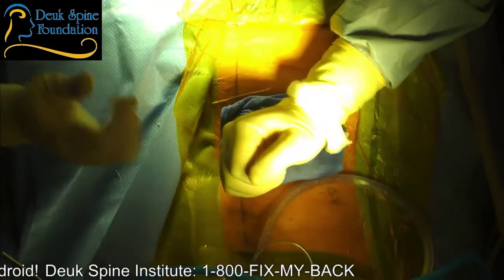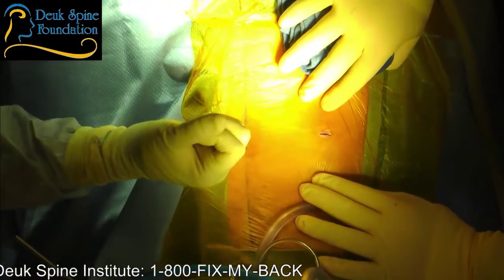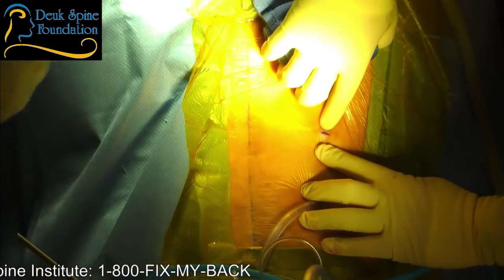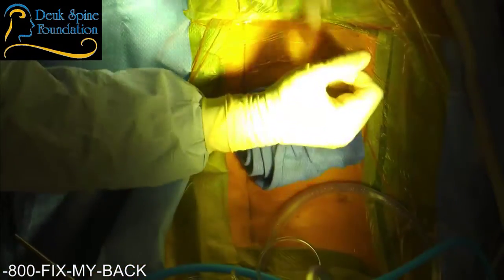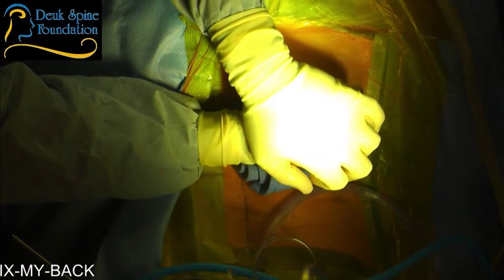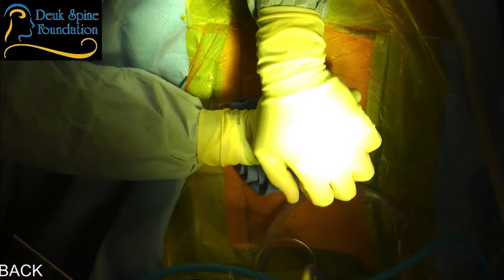All right, you got pressure there? You see the incision, everyone? It's as wide as my fingernail. Tiny, tiny, tiny. So, great job, everyone. Nice job with the anesthesia. Thank you. EBL is 5 mils.